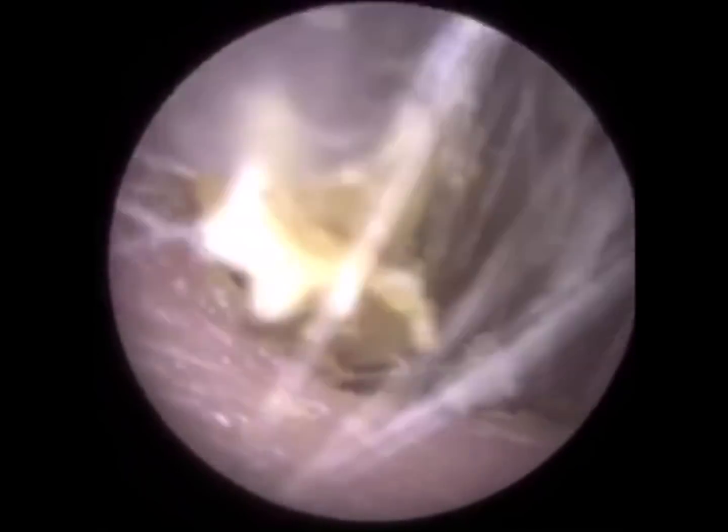But we try and avoid it if possible when we're going deep in the ear. Obviously, forceps wouldn't have been very useful in the right side because the wax was too mushy. So got all the lateral wax out, and as I said, whenever I'm working deeper in the ear, I always like trying to use the Zollner suction probe because you're less likely to make contact with the canal wall and you can just suck the wax out as opposed to getting in behind with the Jobson horn or ear hook and making contact with the eardrum, for example.